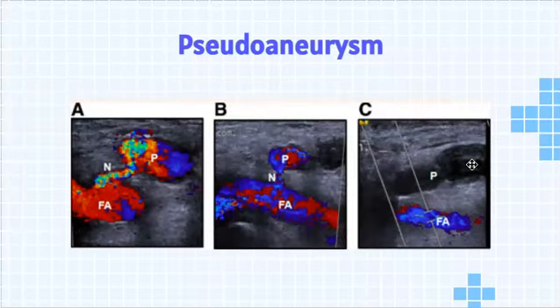So here you can pause the video, and I just want y'all to look at this image and try and figure out what's going on.